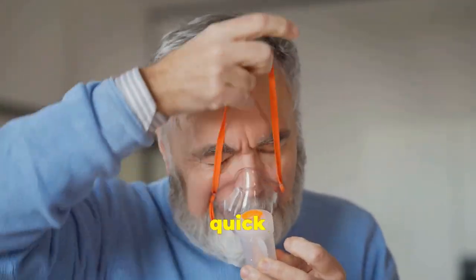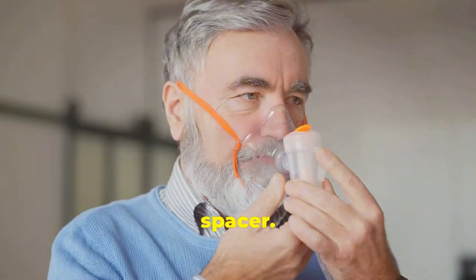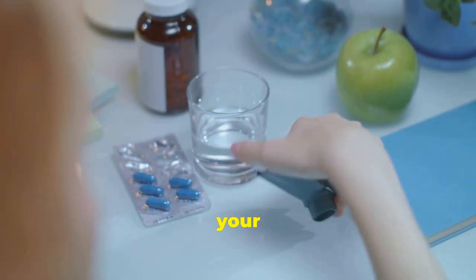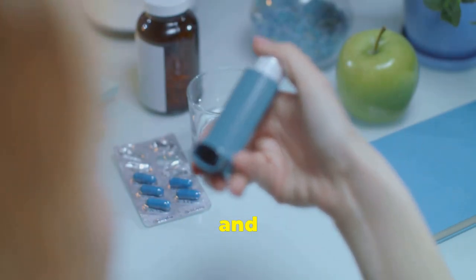Let me show you how to use your quick relief inhaler with a spacer. A spacer is important to use so more medication reaches your lungs to get better relief and less side effects.